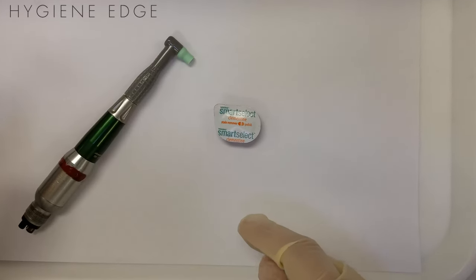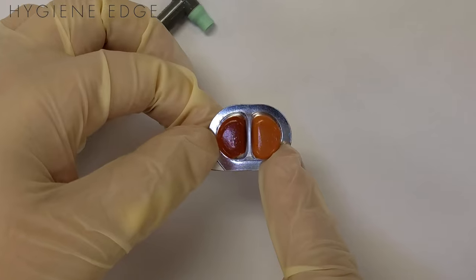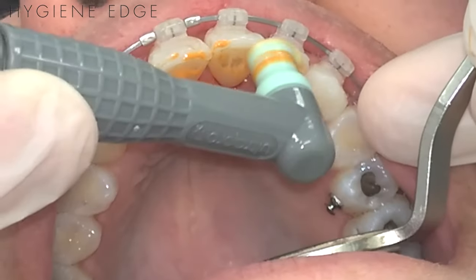This is a new product — it's been around for a little bit — it's made by Young Dental and it's called Smart Select Paste. It's pretty cool because the lighter side is a fine paste and the other is a coarser paste, so you can be more selective with polishing of your patient.